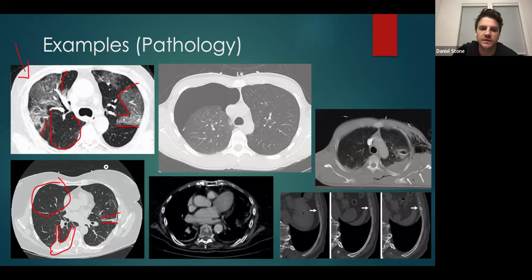Here in the central part, we're looking at what a pneumothorax looks like on CT. You can tell that the pleura basically has collapsed in relation to the chest wall. That's a good example of what a pneumothorax looks like. It's just basically empty space. You'll see loss of the lung markings. You can see all these small blood vessels and all this less dense normal lung tissue. When the lung falls, you obviously just have loss of that. You just have empty space here in this vacuum.